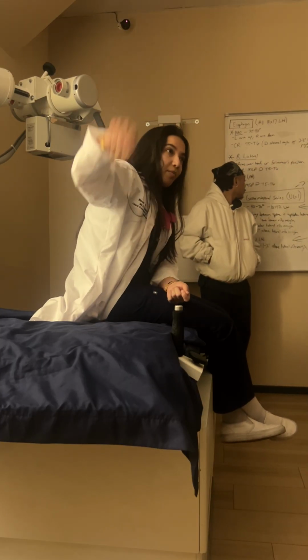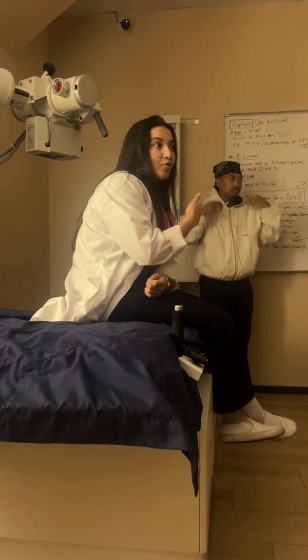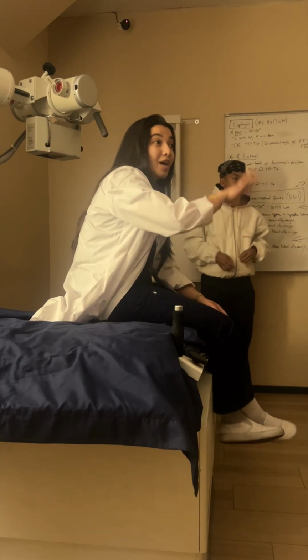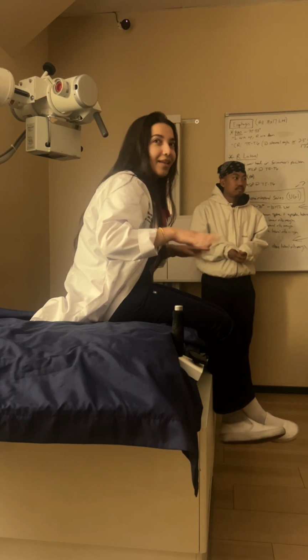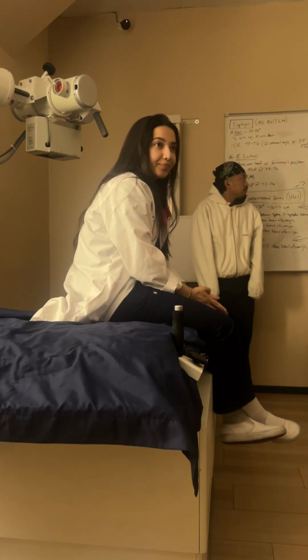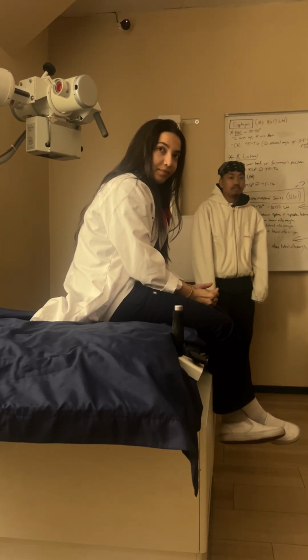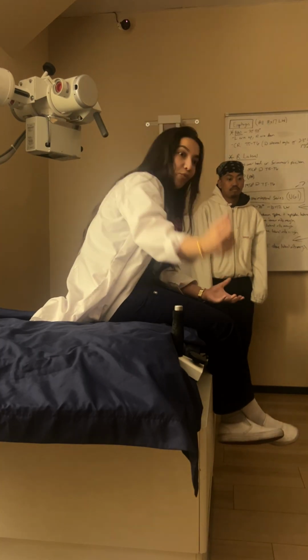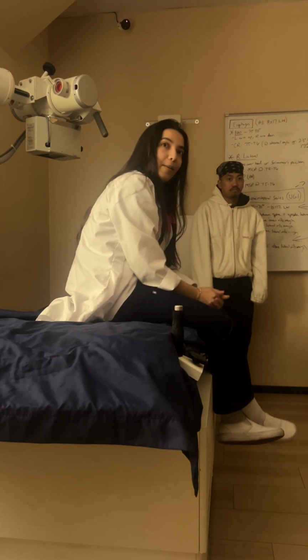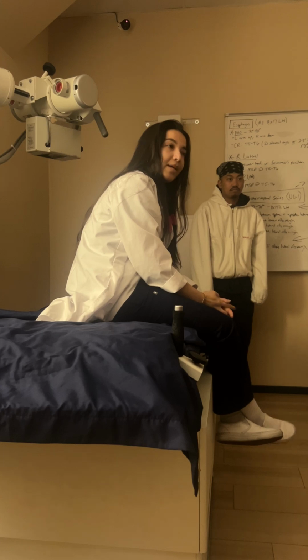I drop the bag, take it out, and then I have them go into the bathroom and clean themselves up. I give them time in the bathroom, because we've got to get everything out. So when you drop the bag, that's when it goes off? Yes, that's when you're going to see everything rush into the bag. Okay. Yeah, because of gravity.